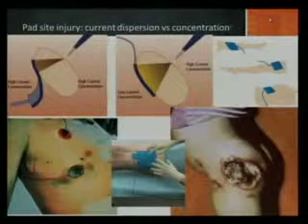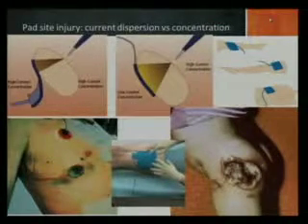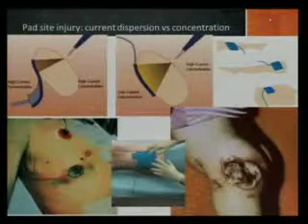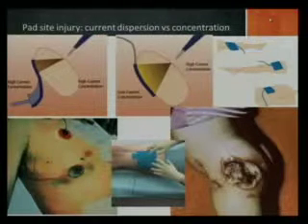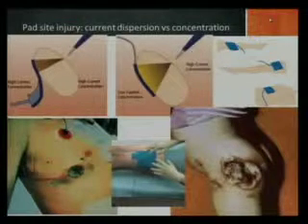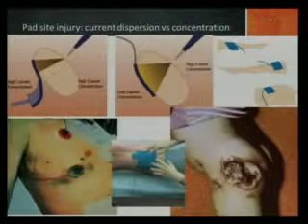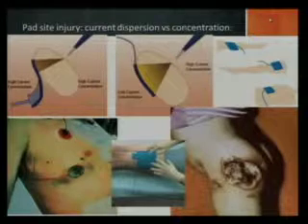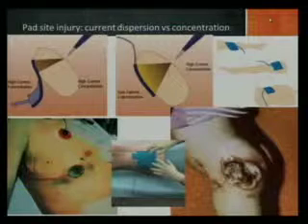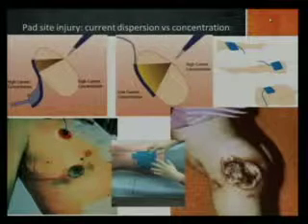When you use these pads, remember that they're single use. Even in the same patient, if you have a pad that gets pulled off, you need to get a new one. You want to make sure that they have really good contact on the patient. For us, because we normally operate in the belly, we usually use the thigh. You want a really well vascularized muscle that's close to your surgical site. Ileana's husband probably isn't going to use the thigh. He's going to use something a lot closer to the patient's head because he doesn't want to increase the resistance, the amount that the current has to travel back to the pad, because that's going to increase the amount of power that he's going to have to set the electrosurgical generator at.